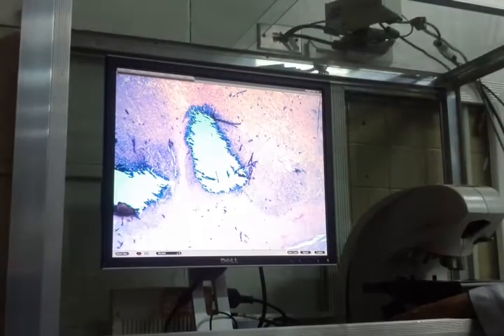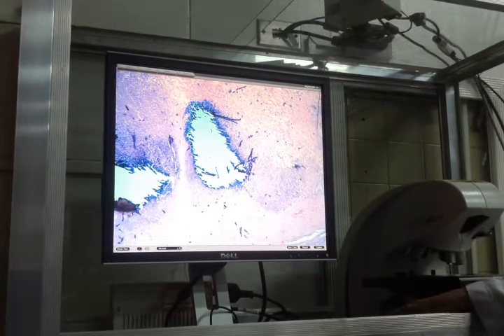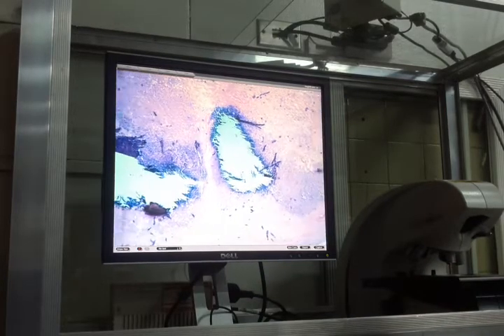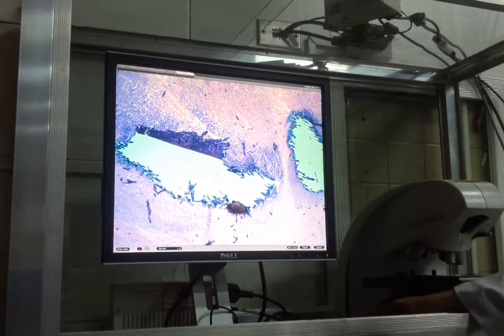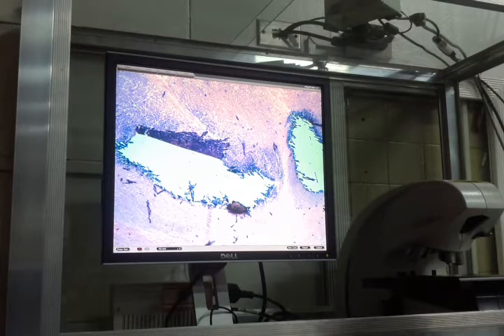So these are fragments of the dystrophic calcification. This should have been here. However, it flew to some other place. We call that, it flew. Okay? Look at that. Because it is hard, because of the calcification, it folds during microtomy. But what I showed you earlier is a very small focus, so it was cut.